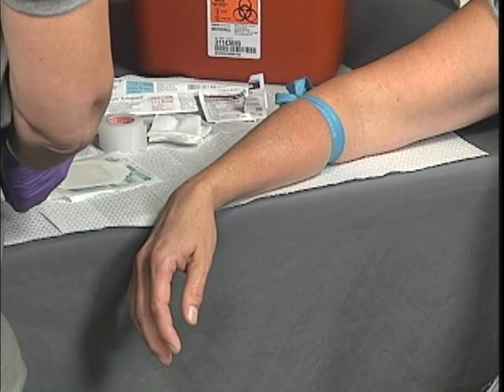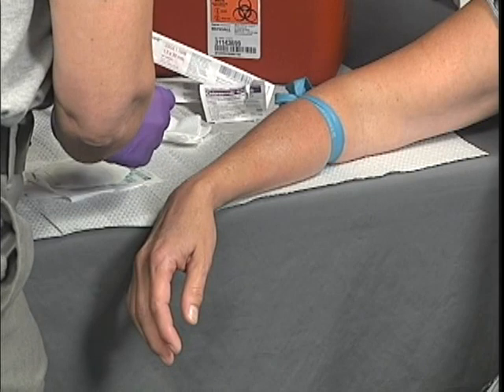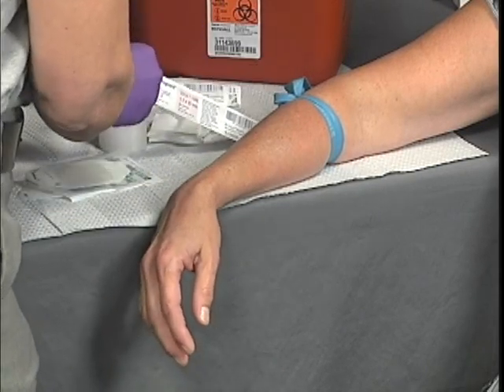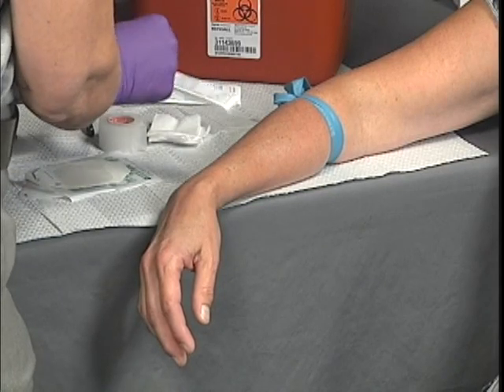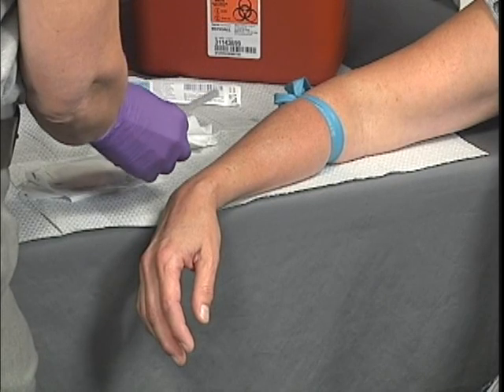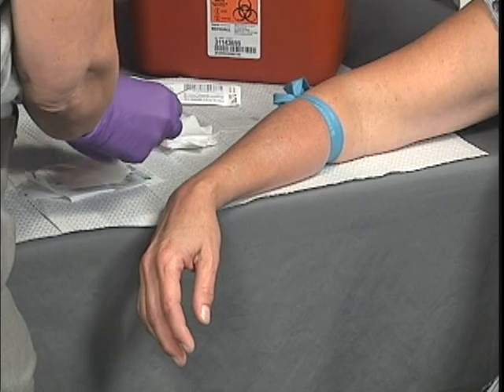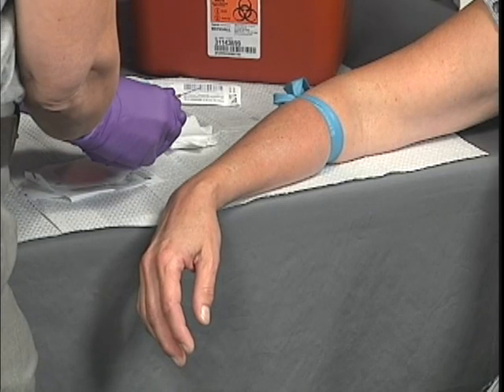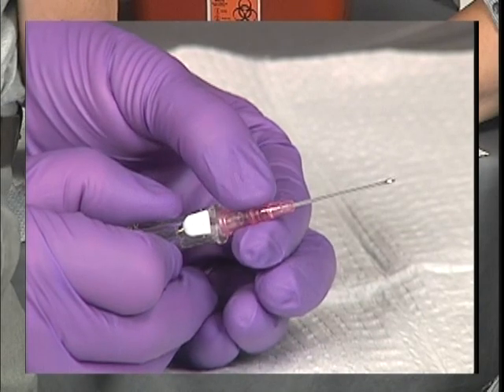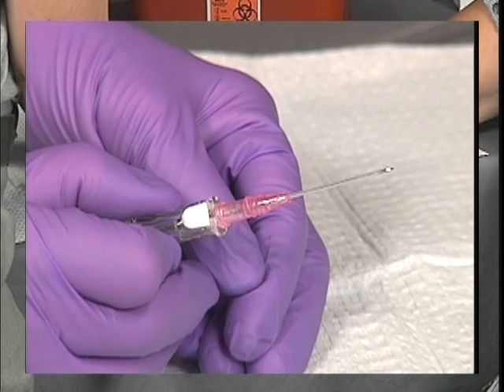Based on the intent of the IV and the size of the vein selected, choose an appropriate size IV catheter. Remove the catheter from its packaging and the protective sheath, being careful to maintain sterility of the needle and catheter. Visually inspect the end for any defects such as burr edges. As an optional step, slightly twist the catheter to ensure it moves freely on the needle.